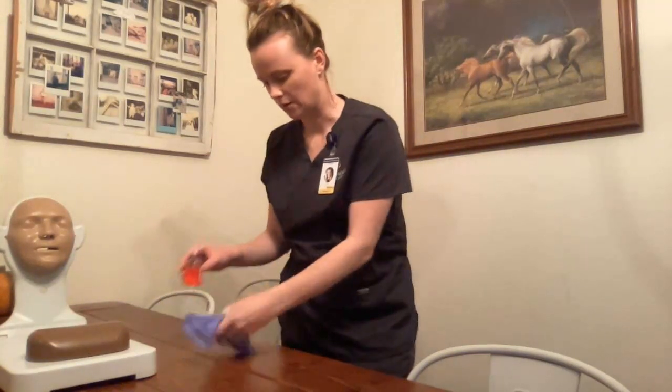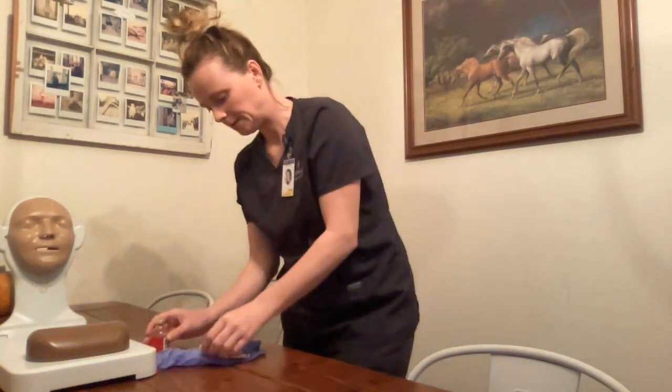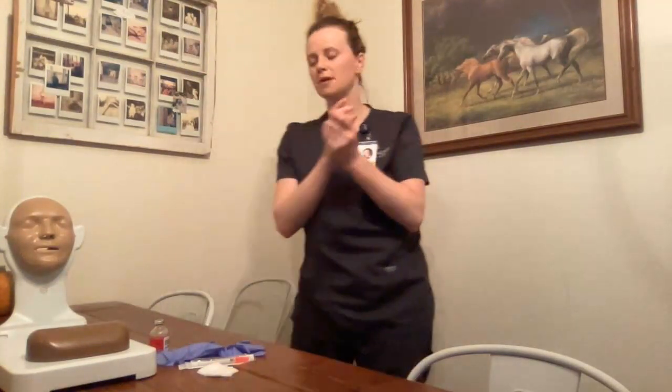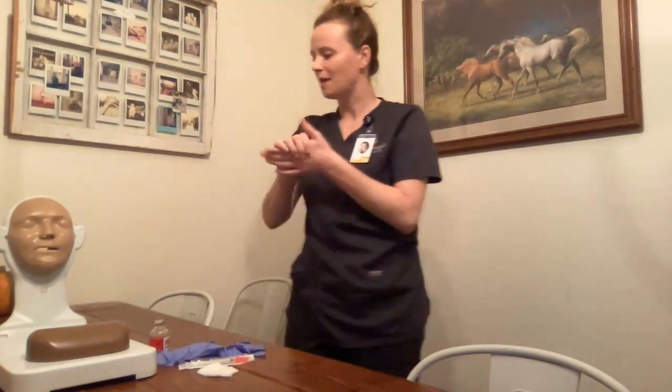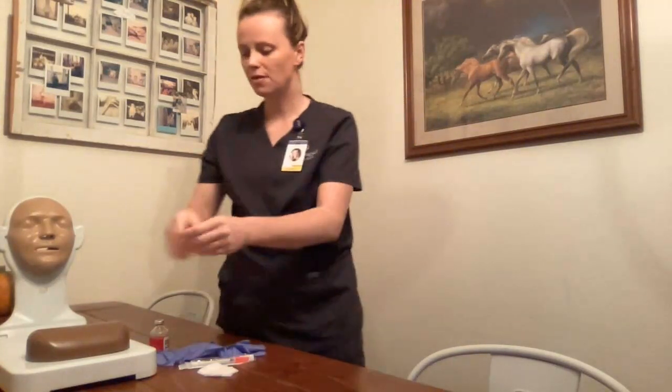My supplies are ready to go, so I will head to my patient's room. I will knock, enter, and close the door behind me to ensure patient privacy and to avoid any HIPAA violations. I'll set my supplies down on a clean, dry, flat surface. I'll perform hand hygiene and introduce myself to the patient: 'Hi, Mr. Smith, my name is Emily. Can I please have your name and date of birth?' I verify with their wristband, and that counts as my two-patient identifier.